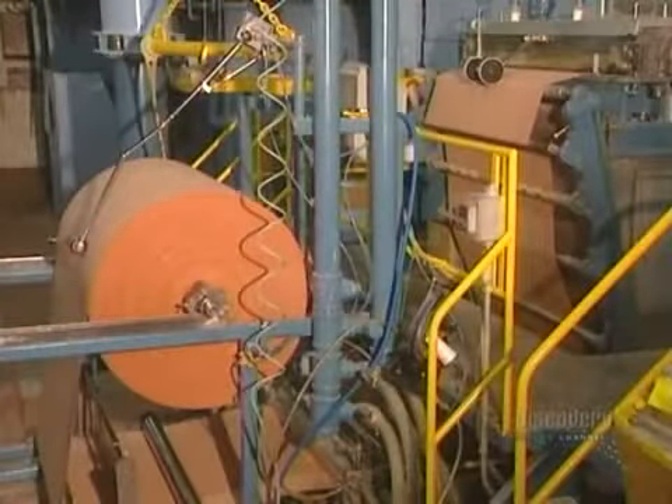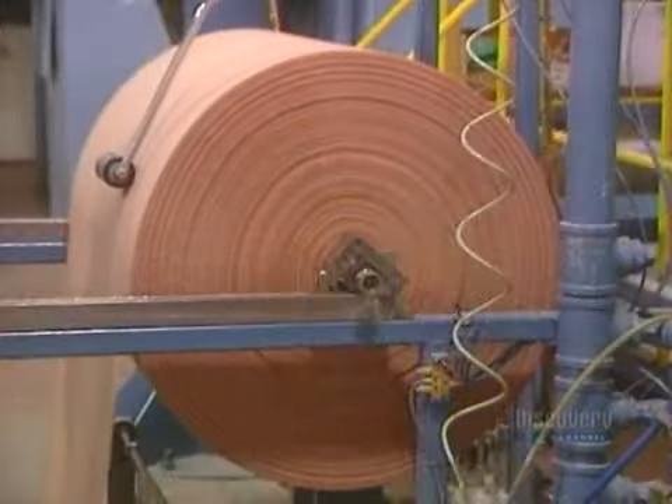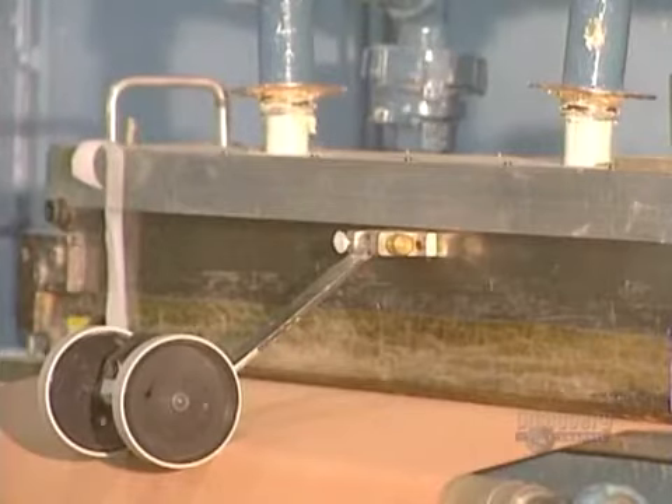This 1,800-meter roll of fabric can make 1.8 million small bandages or 300,000 large bandages.